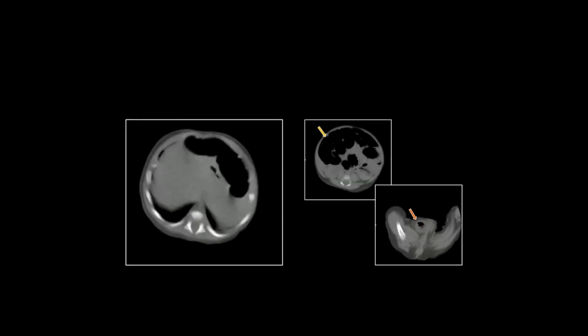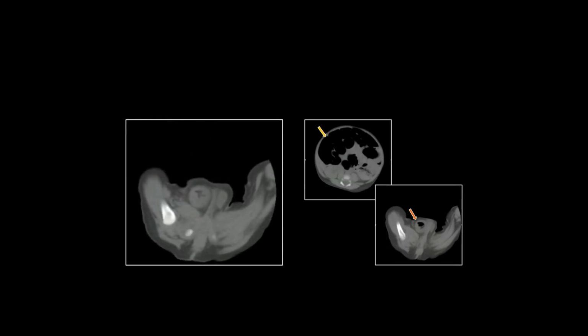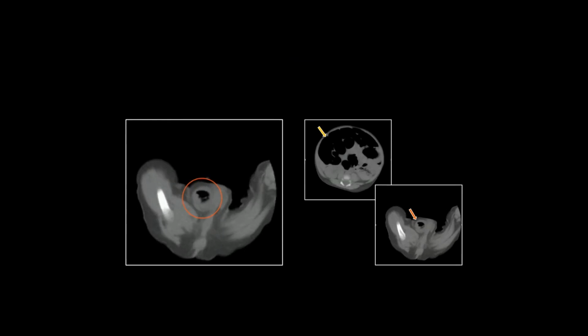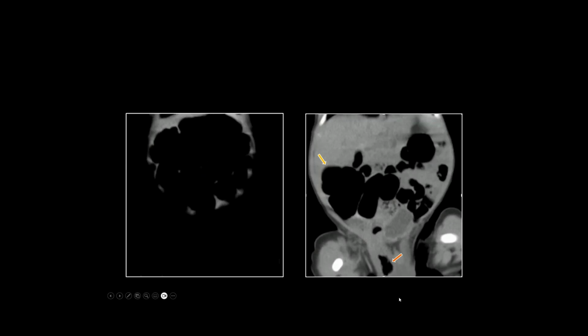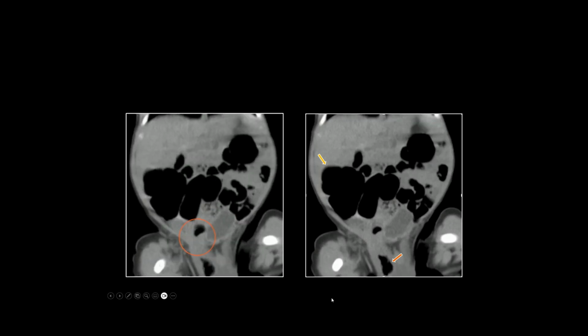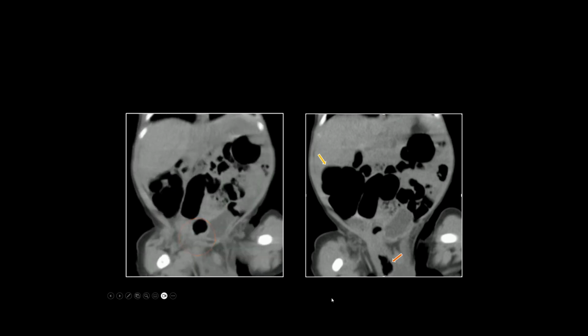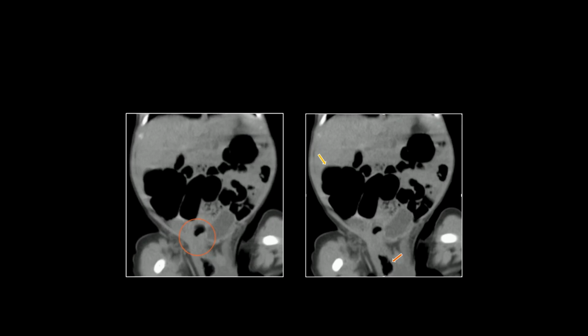So in radiology, it's no more accessible than any other part of the body, but definitely remember to look down there. I've got a coronal on this, which is great because you can see it coming through the inguinal ring right there. Right, and that herniated bowel is getting a little thick-walled as well. And that's a big point with our ER referrers. They always want to know, is there evidence of strangulation?